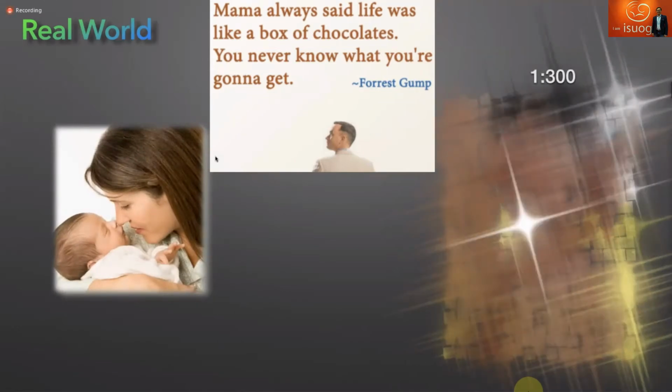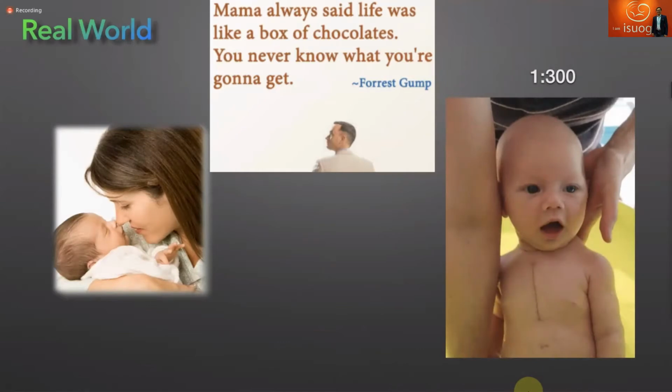But in 1 in 300 cases you may receive, if things go well, a picture of the child after surgery, because as I told you, 1 out of 300 cases have a cardiac anomaly, a severe one. This is why you should know this, and ideally try to make the diagnosis properly prenatally to have, let's say, a thank-you letter instead of a letter from an upset patient.